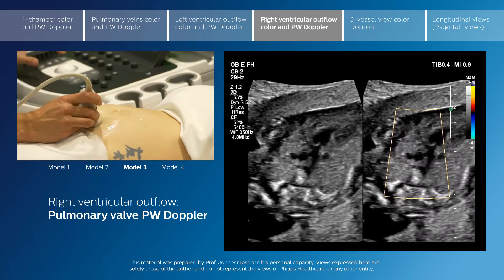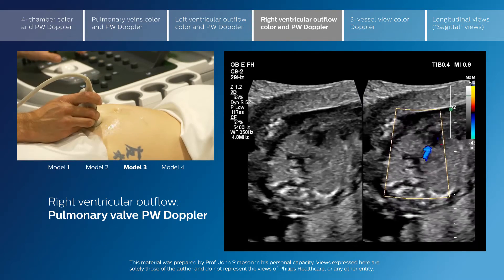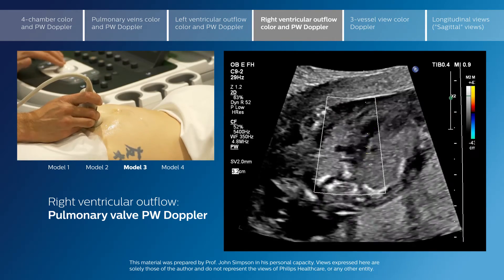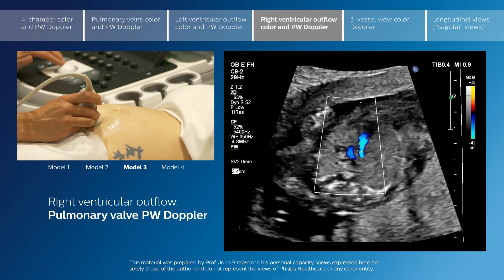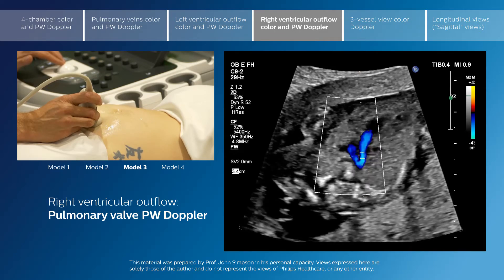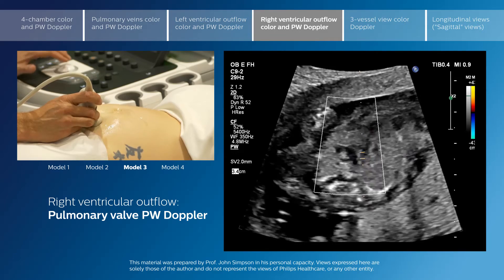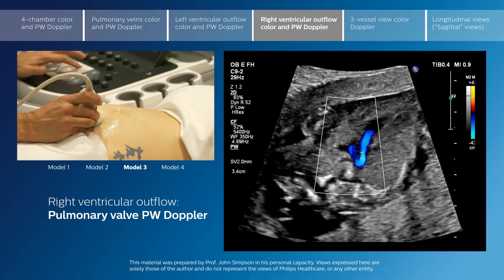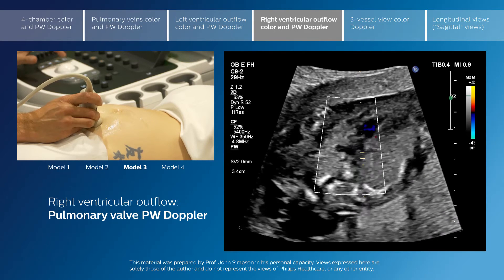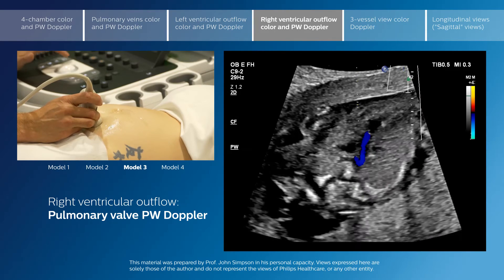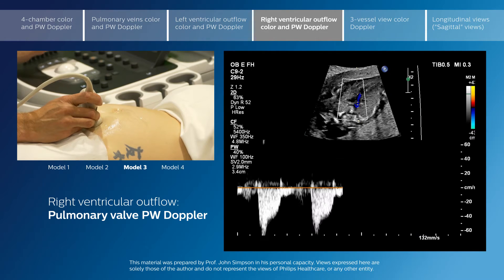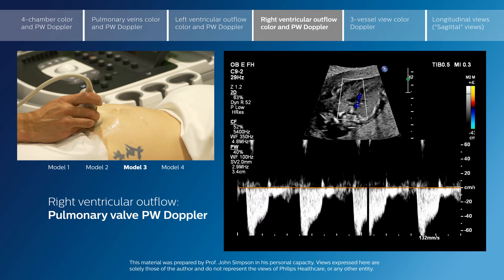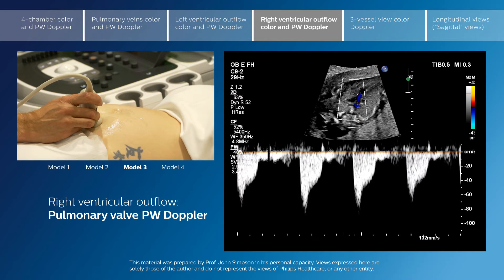Be very careful that in scanning you don't drift down into the arterial duct, because if that happens then what you will see is that you register a much higher velocity.